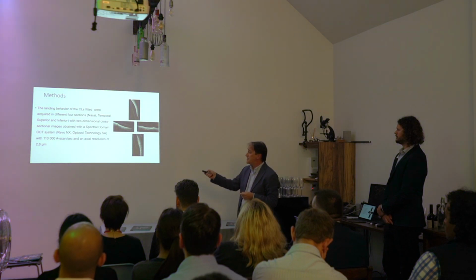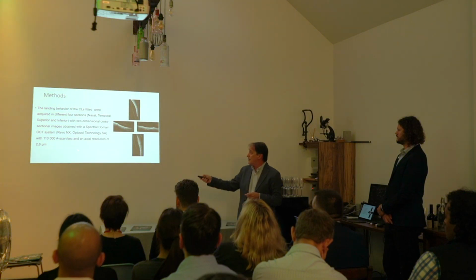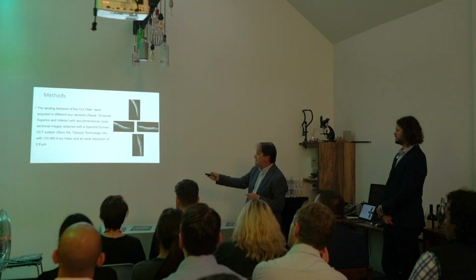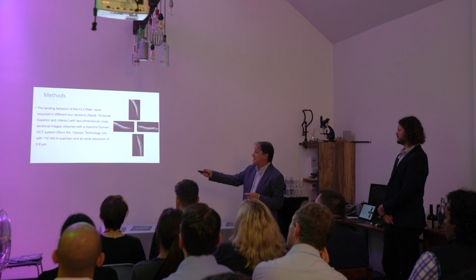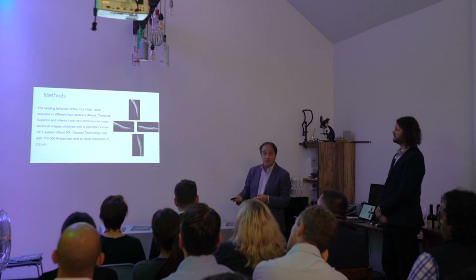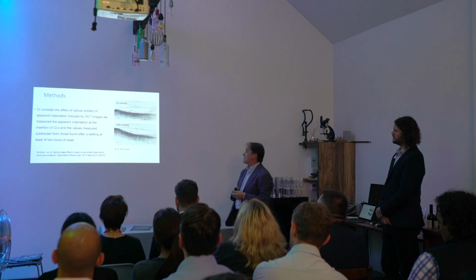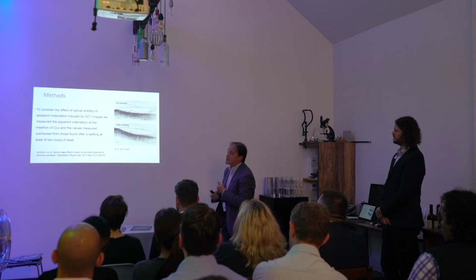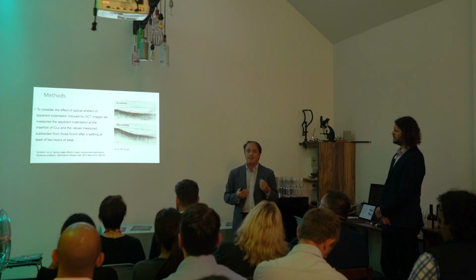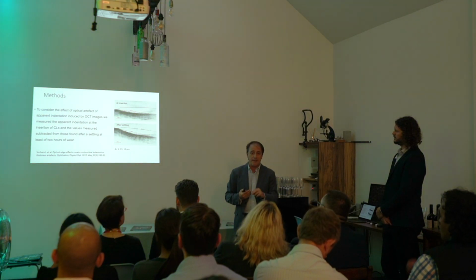This is an OCT from Optopol with a resolution of 2.6 micron and 110,000 scans per second.